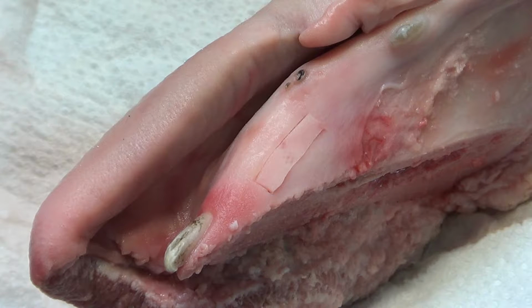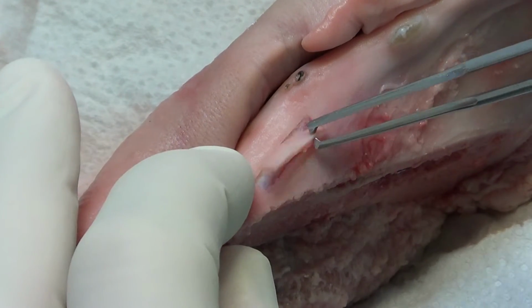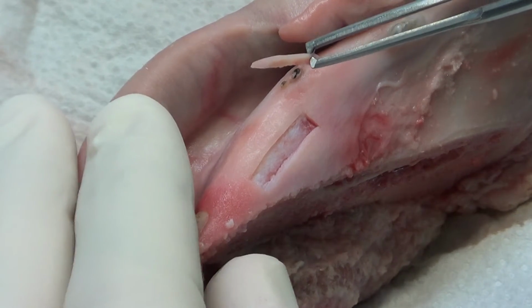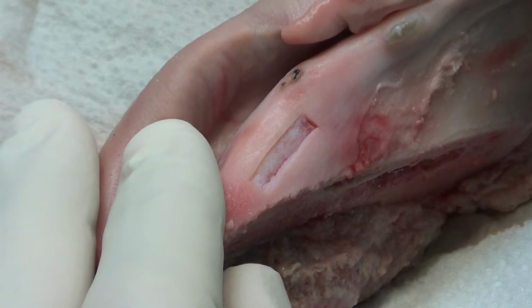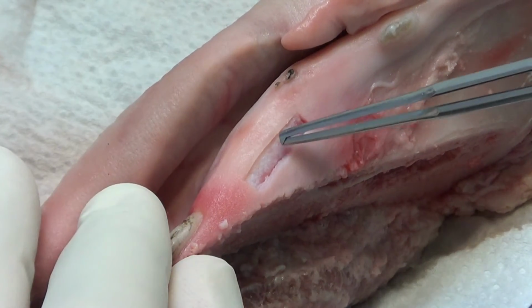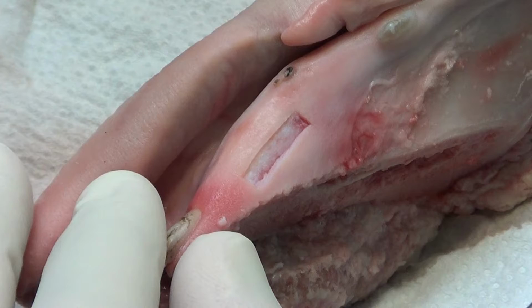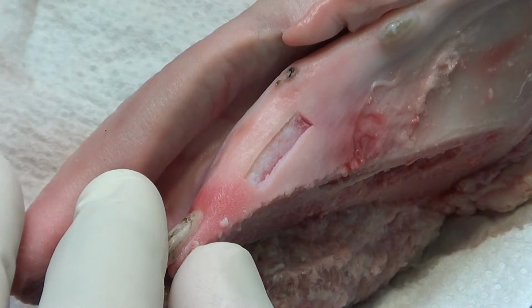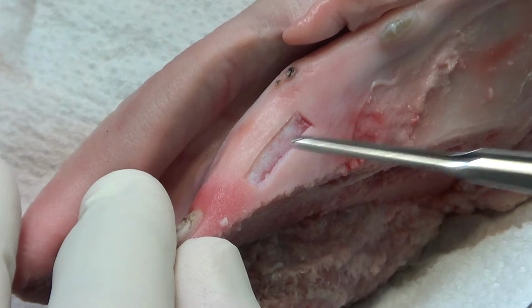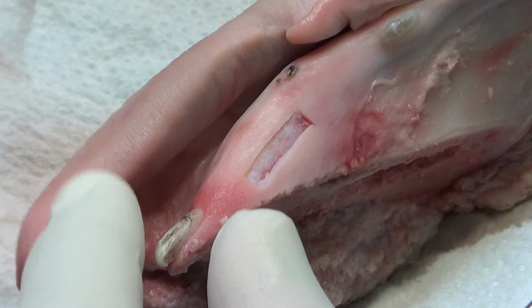Thank you very much. Imagine to have the sponge inside, like Spongostan or whatever you use. So you put it inside the sterile water, then here you put the sponge. If you use Spongostan, for example, you cut it into the middle and you use only half of the sponge and you put it inside. The blood blocks the sponge, so the sponge is stable in the wound.